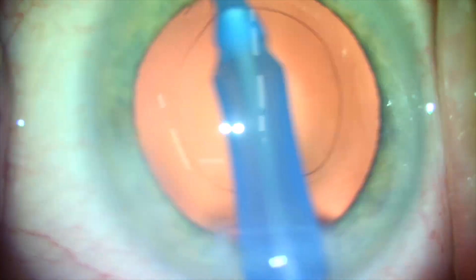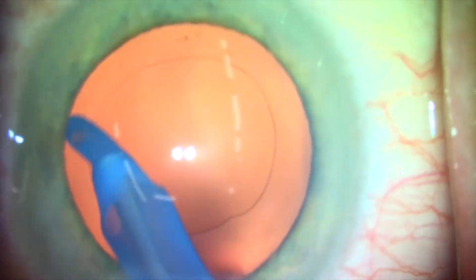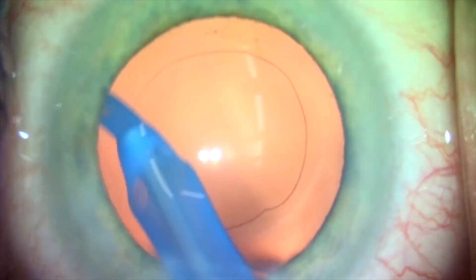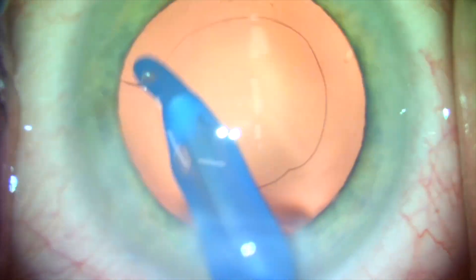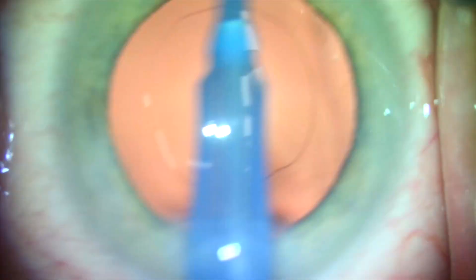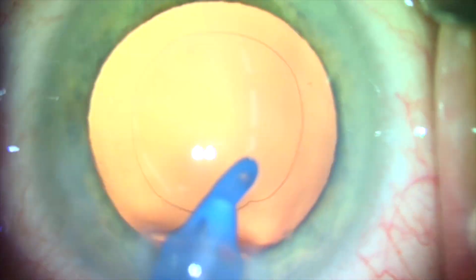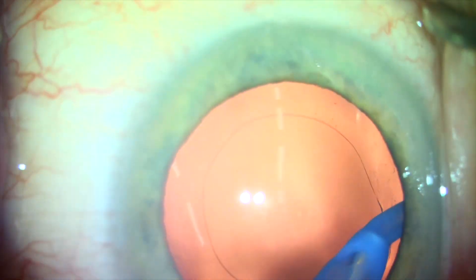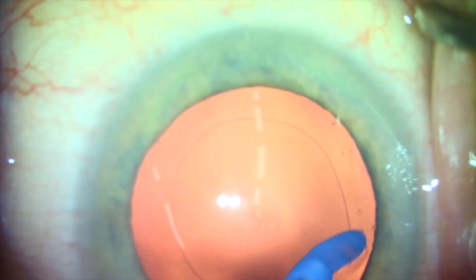I do not aspirate moving from top to bottom or aspirate in two directions, in order to avoid inadvertently tearing the posterior capsule. Using this instrument with this technique has proven to be extremely safe and effective for creating the clearest posterior capsules possible during cataract and lens replacement surgery.